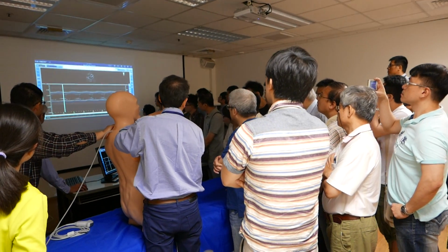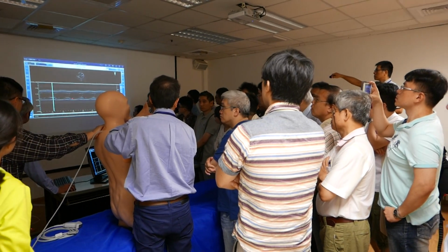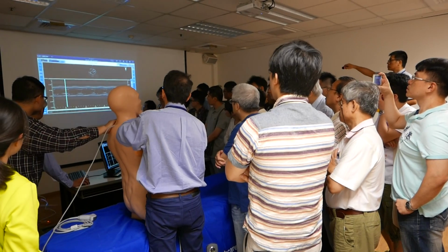We will do that during the hands-on this afternoon. I will show you how it goes. But this is as simple as that. Thank you. Back to the 2D, please.